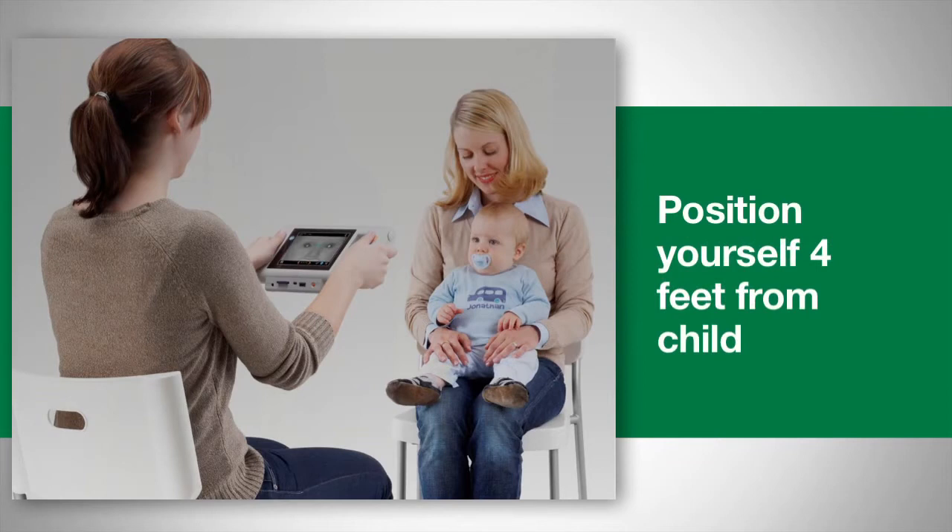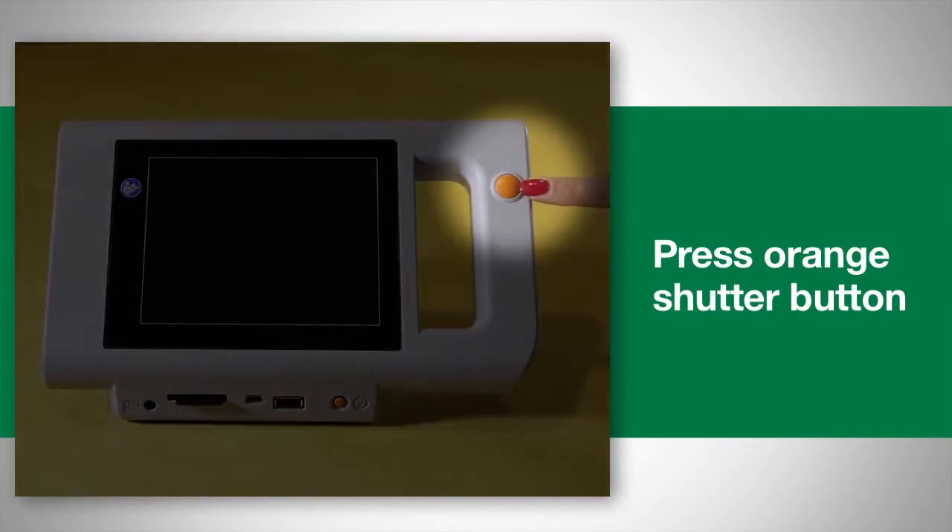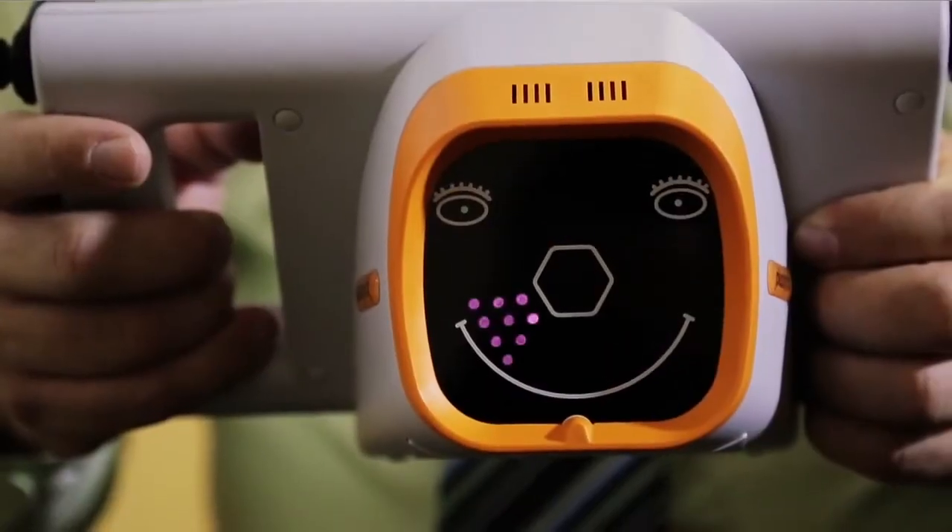Hold the device at the child's eye level and press the orange shutter button. The warble sound attracts the child's attention to the device.